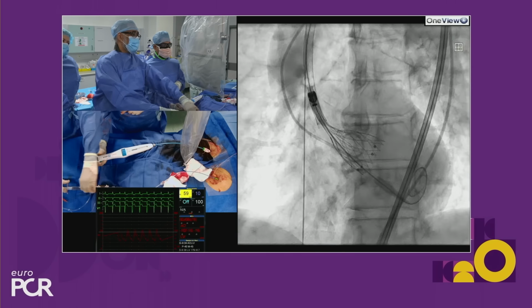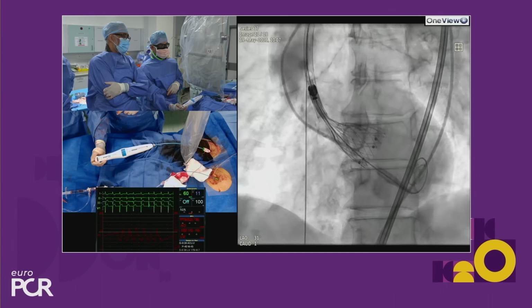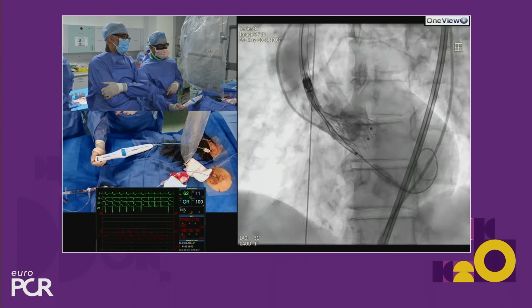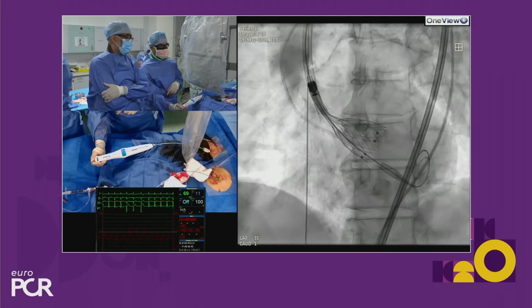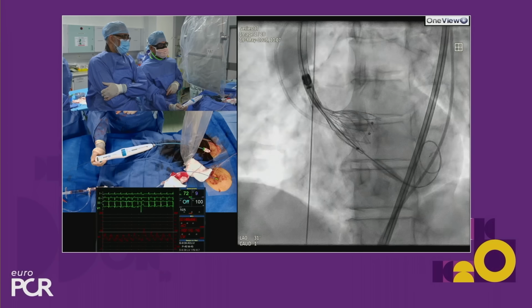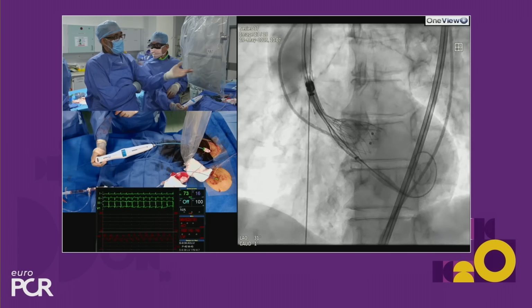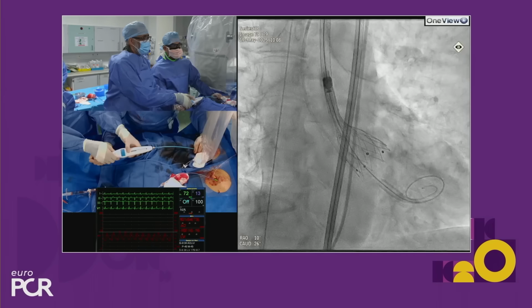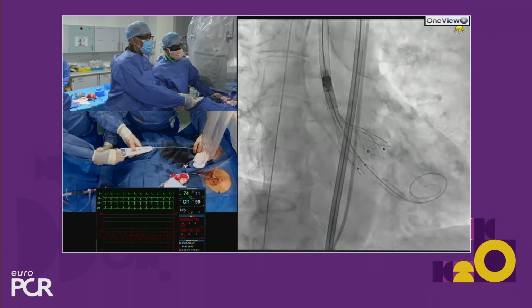Yeah, okay, so you can see that's the view that would show us the left coronary artery, and I think it's not unreasonable. So I think the height's reasonable, I think alignment is reasonable, not that we can control it very much, and I think I'd be ready to deploy this valve. And expansion is good. And expansion is good, exactly. So I'd be very happy to deploy this valve. So we'll press the button so that we can then continue to release the valve.